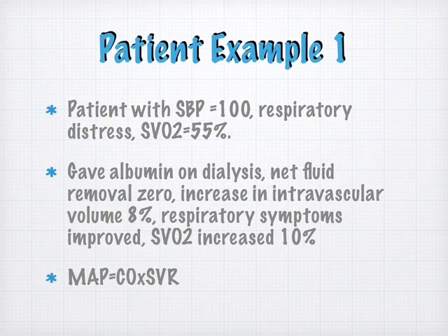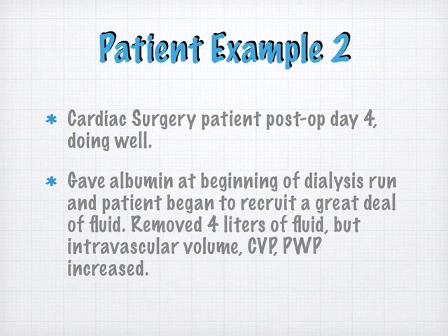Hers was higher, but the point was that she then had cardiac output blood pressure, not resistance blood pressure that was caused by dehydration. So it was very helpful to be able to have the SVO2 on her. And if I was just looking at blood pressure, I might have thought that that was a good blood pressure for her. But having SVO2 and actually being able to watch her blood volume change helped me to understand what was happening with her and why it is that she actually felt so much better at the end of that dialysis run.